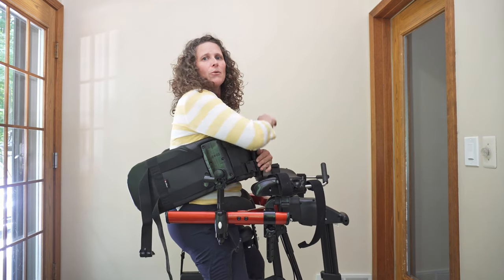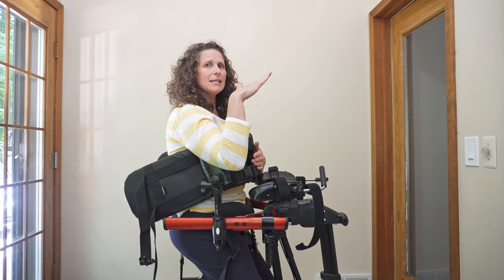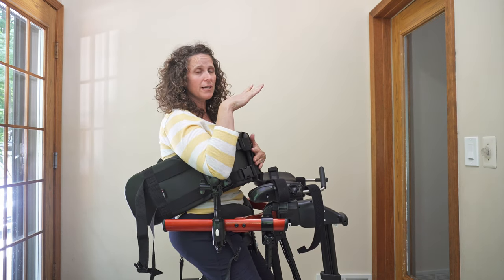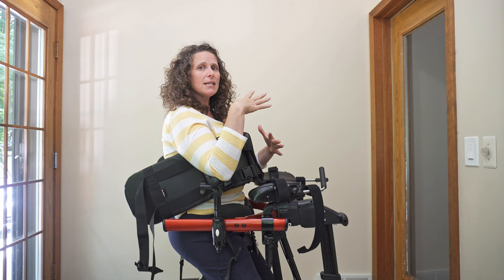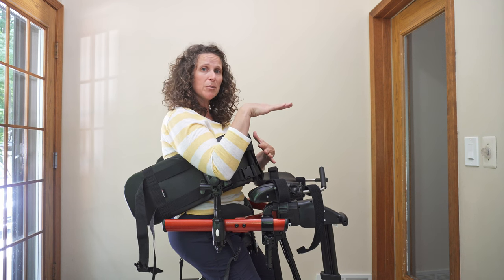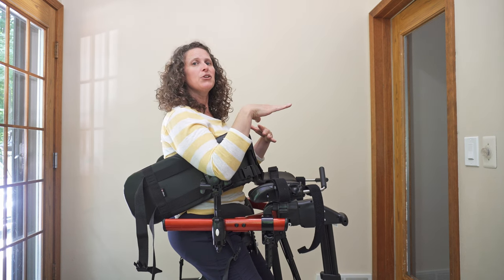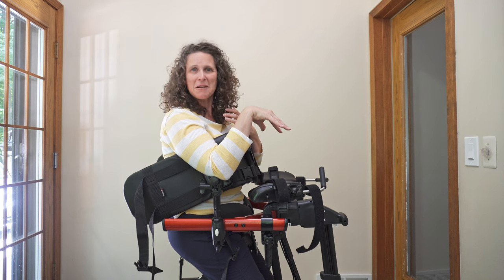Right now my seat is tilted back, so it allows me to be in that posterior pelvic tilt. When you allow that posterior pelvic tilt, you can really focus on opening up that chest. If you put them in an anterior pelvic tilt and open up their chest, it might just be too much at one time.